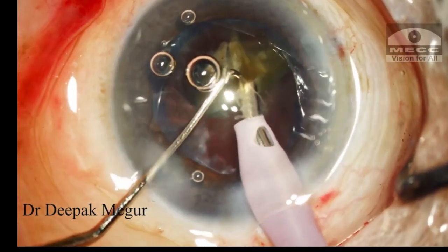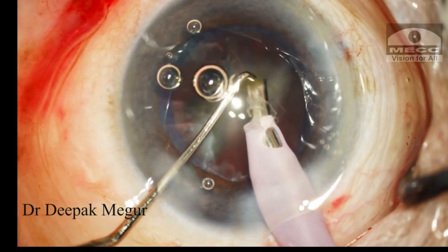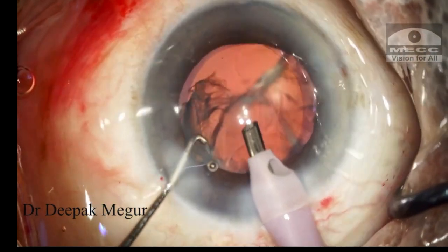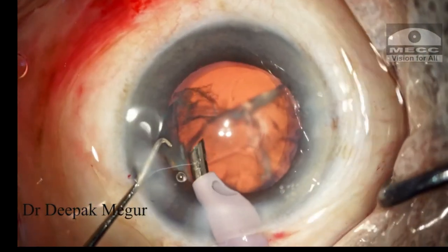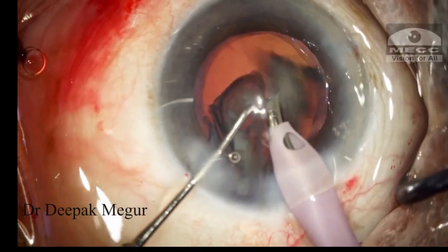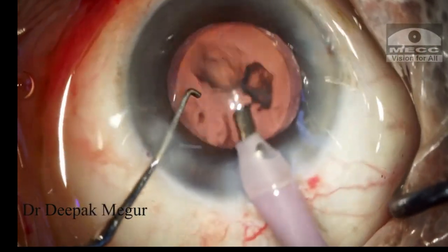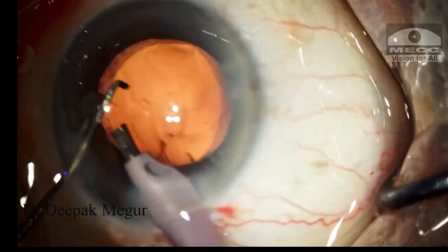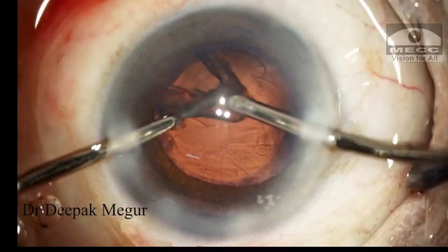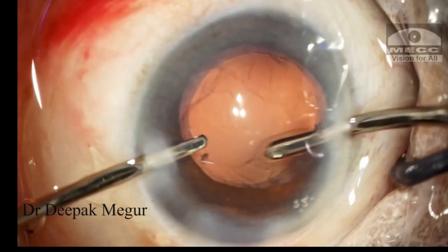I prefer to place it much nearer the endothelium. And methylcellulose is placed under it, that is, at the level of the rhexis and into the capsular bag, which is where the phaco tip would be and the heat would be generated. So finally, the last fragment is emulsified. Wound burn will also be a concern, but not so much with torsional though. But I usually ask my assistant to keep pouring BSS on the region of the incision.